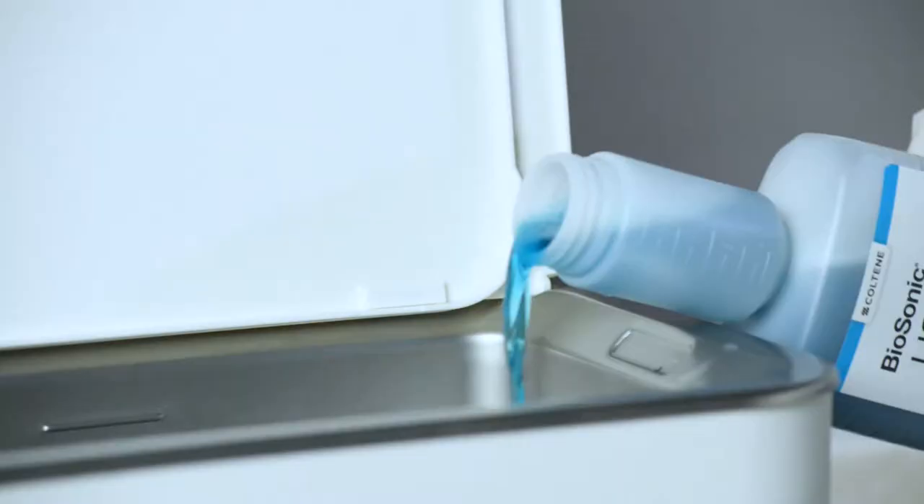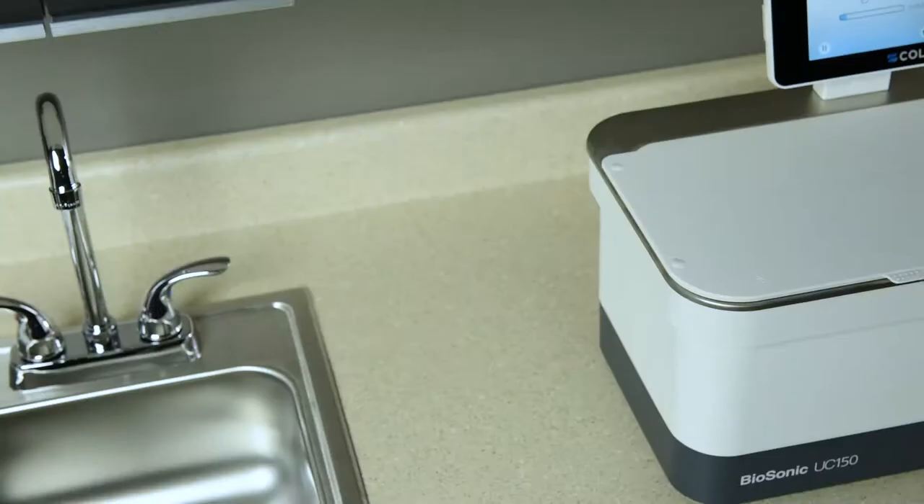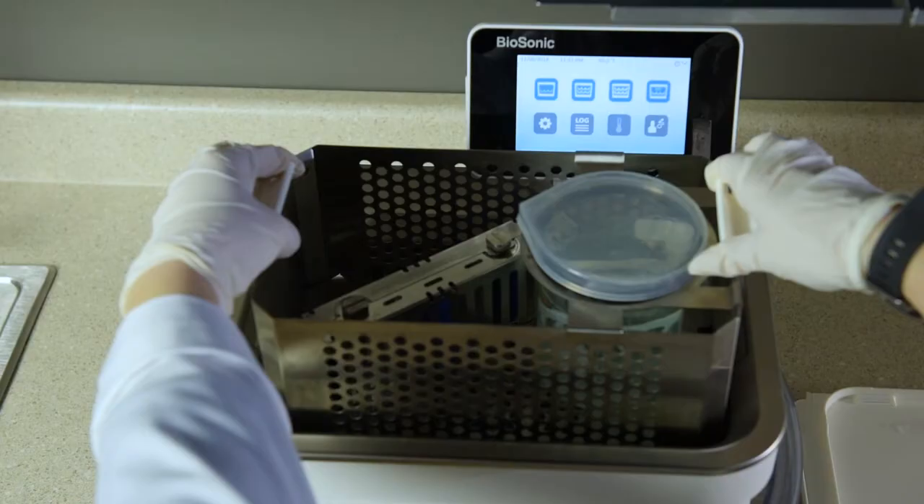Why is there a high-pitched sound coming from the ultrasonic cleaner? When a unit is initially filled up with a fresh solution mix, there are lots of bubbles in the solution. If the unit is turned on right after fresh solution is added to the tank, there may be a screeching sound.